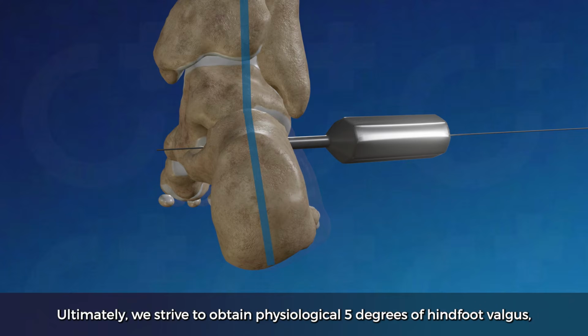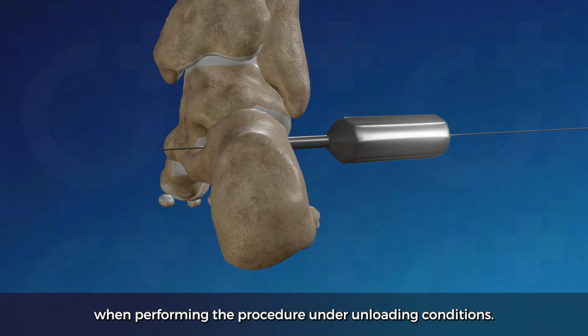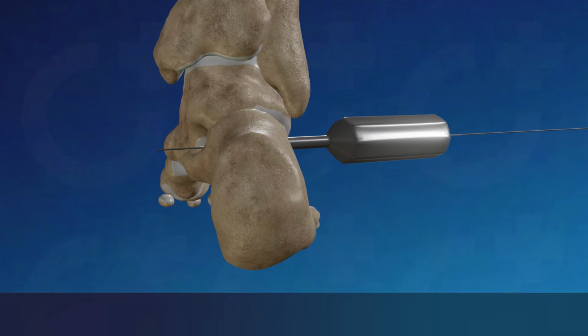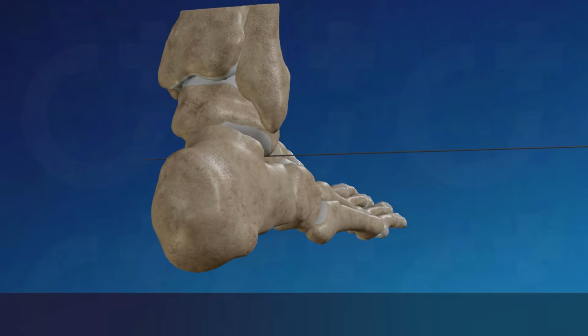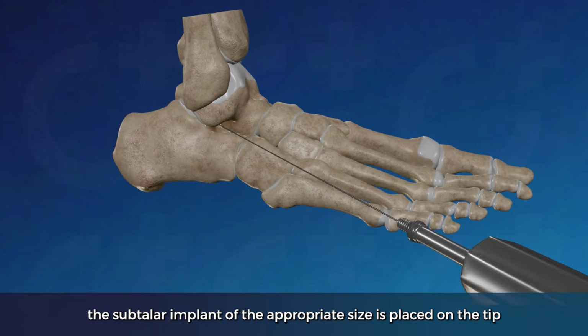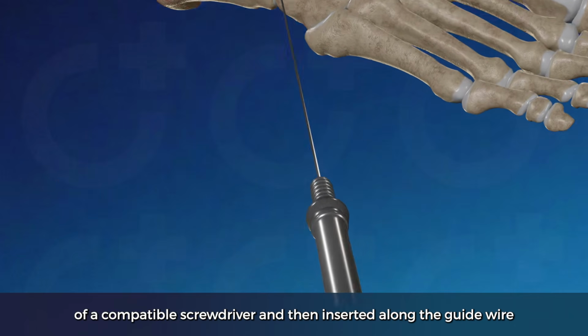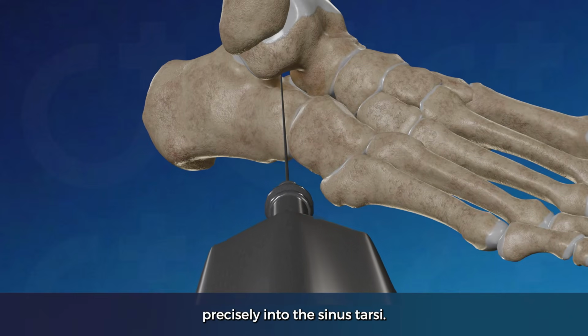Ultimately, we strive to obtain a physiological 5 degrees of hindfoot valgus when the foot is weight-bearing. The surgeon must take this into account when performing the procedure under unloading conditions. In the next step, the subtalar implant of the appropriate size is placed on the tip of the compatible screwdriver and then inserted along the guide wire precisely into the sinus tarsi.